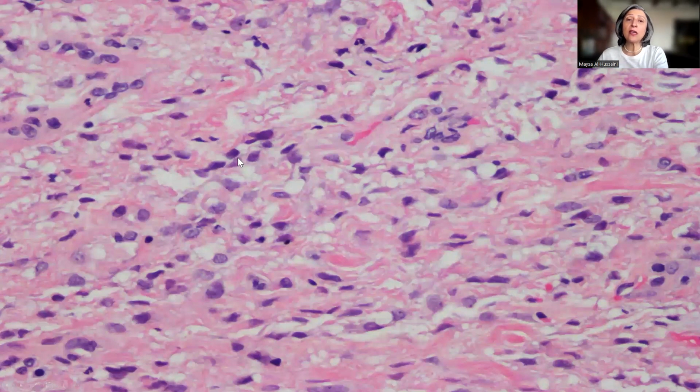So the differential diagnosis really is that of stromal proliferation or stromal lesion, including a large number of differential diagnoses like cervical polyp. Could this be something that is leiomyomatous? Could this be spindle cell proliferation, for example, neuromatous, neurofibroma, other differential diagnoses that can be encountered in that location.